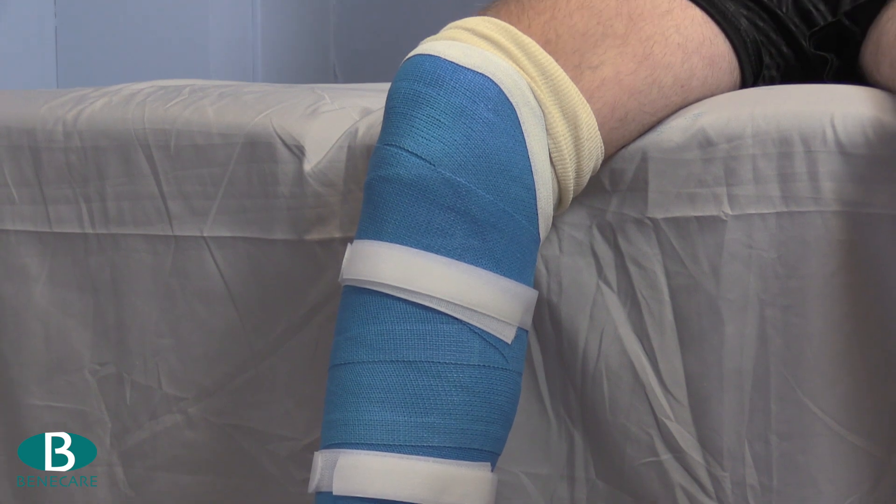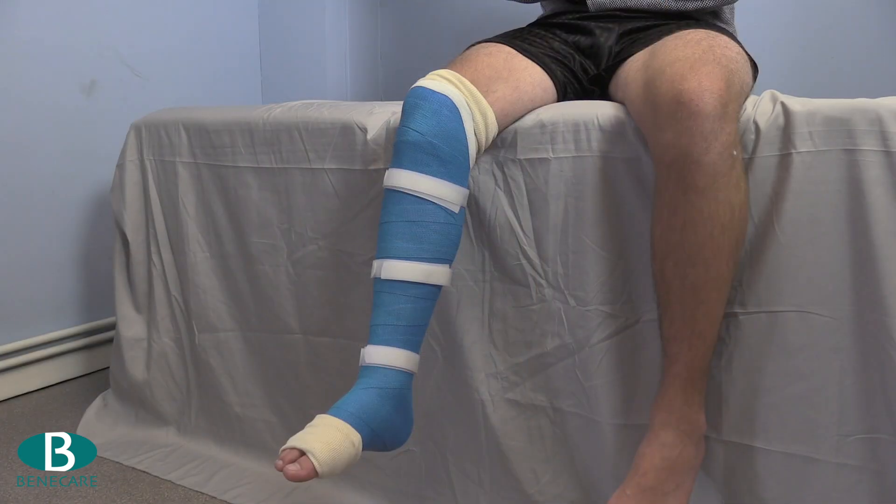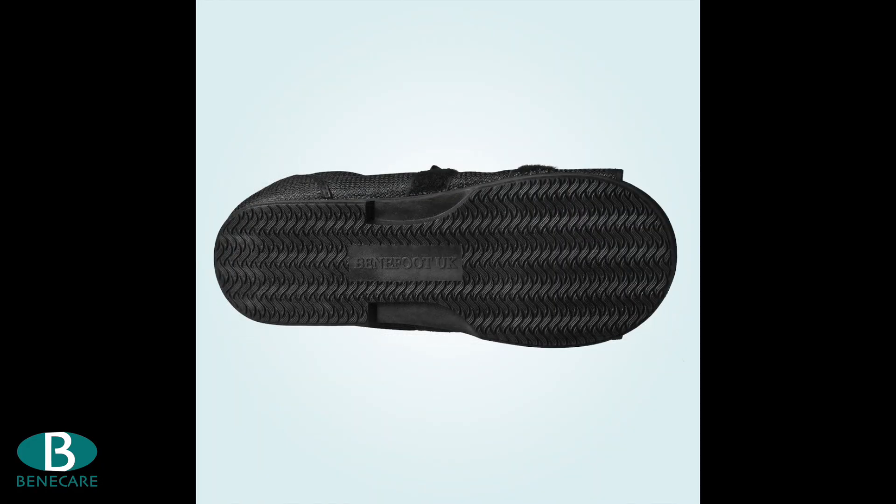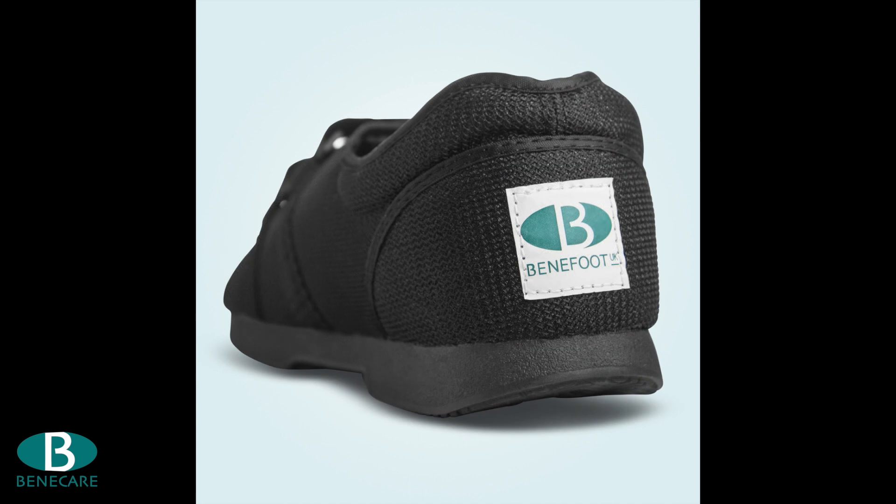Ensure the cast is secure and comfortable and provides good functionality for the patient. A Benecare post-op medical shoe can be used for mobilising.